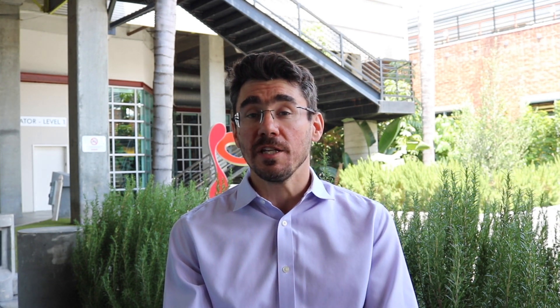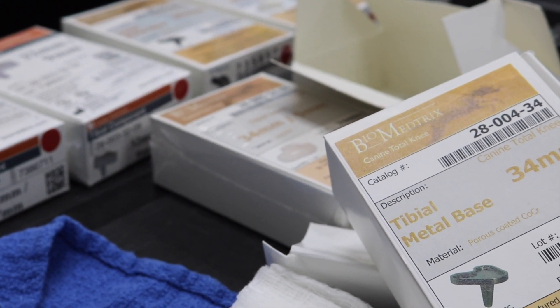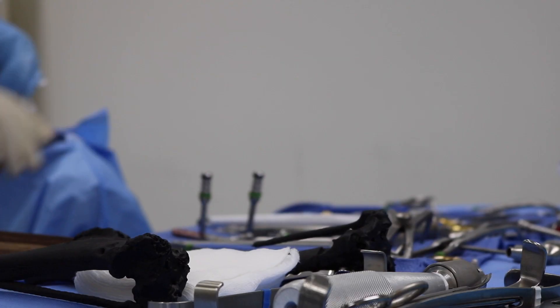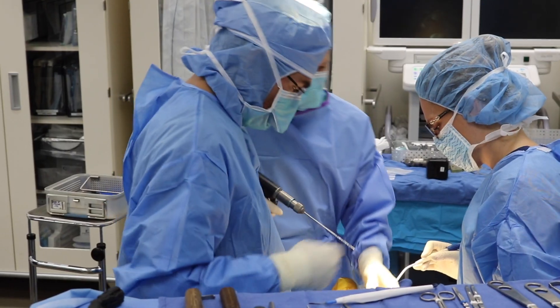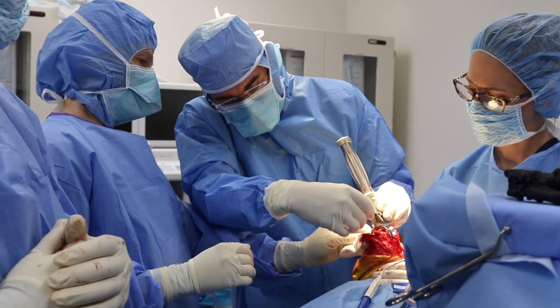It's called a total knee replacement because we're replacing the entire knee. The only thing that we keep, really, are the soft tissues around it. The procedure itself is about an hour and a half, two hours, rarely less than that. It's one of the more complex procedures we get to do.